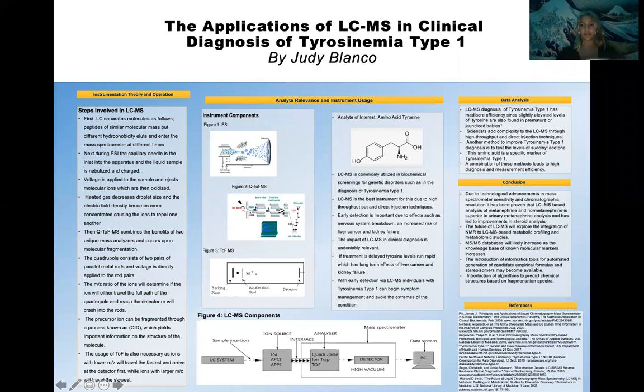Hi, my name is Judy, and my poster is on the applications of LCMS in clinical diagnosis of tyrosinemia type 1. In LCMS proteomics, complex mixtures of proteins are subjected to enzymatic cleavage and undergo analysis using a mass spectrometer.